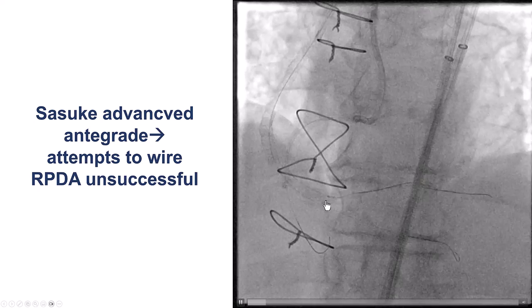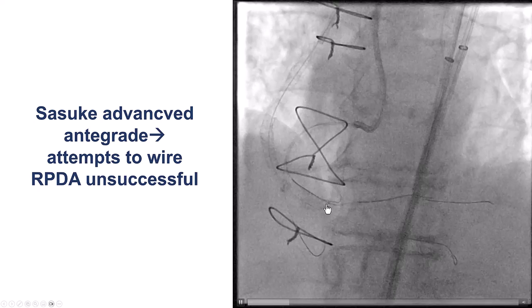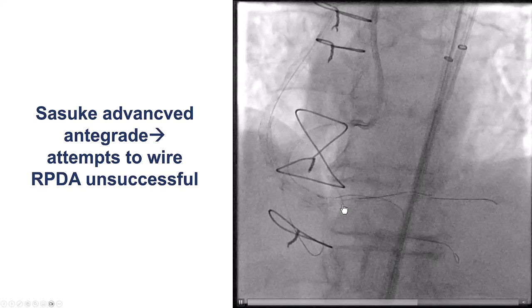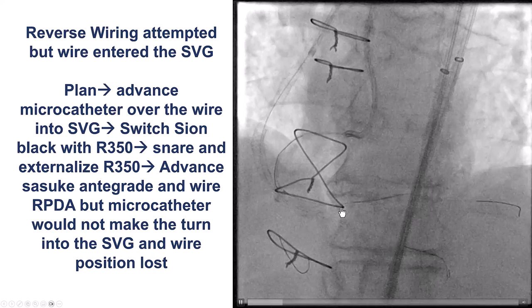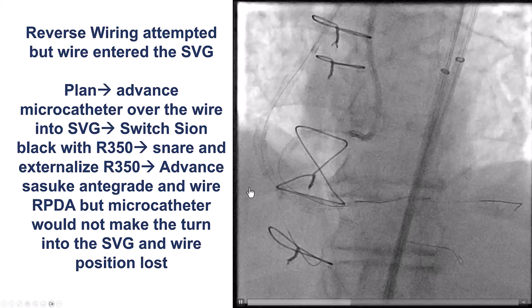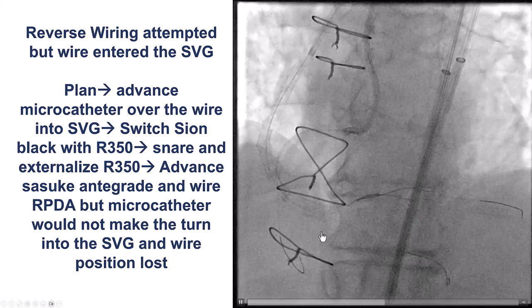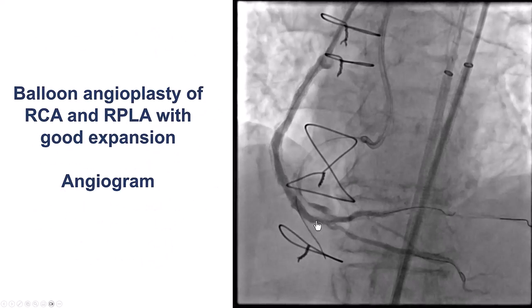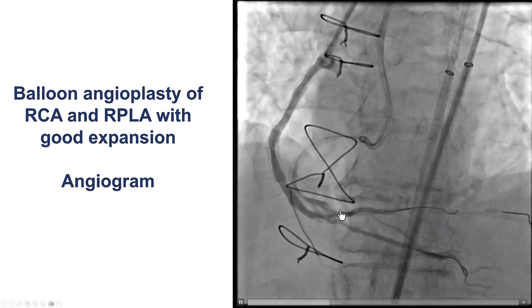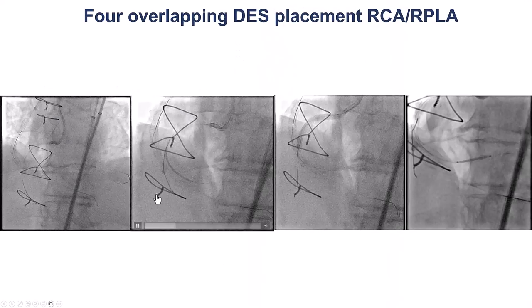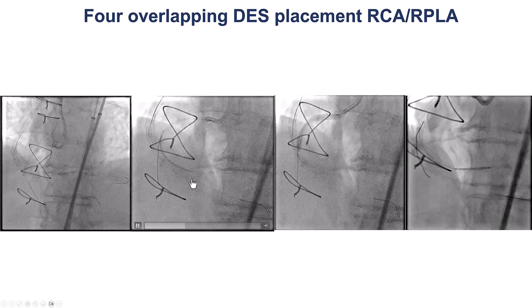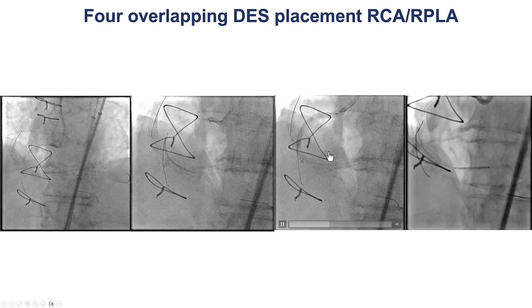We still wanted to get a wire into the right posterior descending artery. We used the Sasuke dual-lumen microcatheter, but the angulation was just too acute and we could not get the wire to go backwards. We tried the reversed guidewire technique, but that didn't work either, and we just could not make the bend. We ballooned the RCA and the right posterior lateral and had some good expansion of the vessel. We then decided to stent — even though we had not secured the PDA, we did have access to it through the saphenous vein graft, which would help troubleshoot if there was a problem, and this became very important later on.